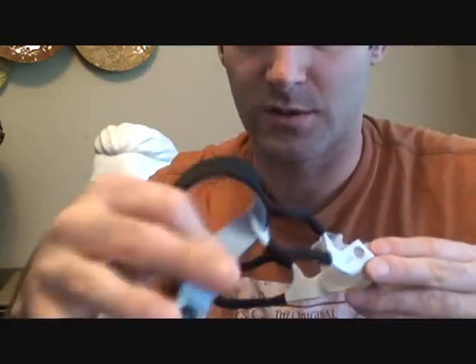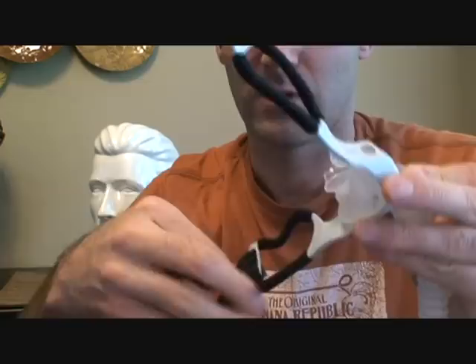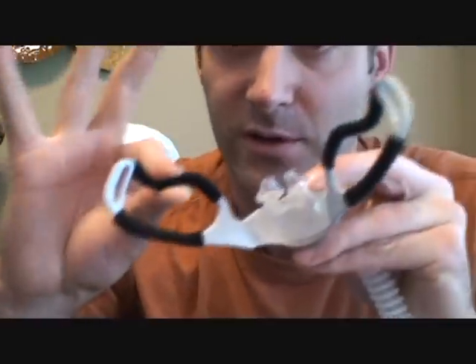To get the headgear off, just undo the Velcro and pull through — undo the Velcro, pull through. This has some kind of material here that's meant to protect your face. I think it's kind of scratchy to be quite honest, but it is a barrier and it's better than the plastic.